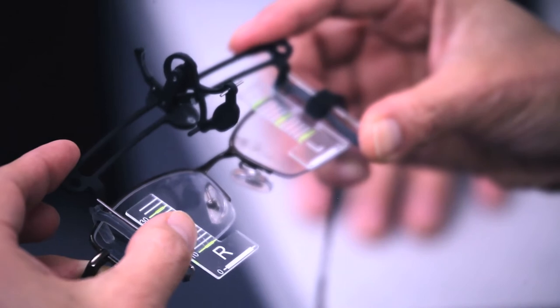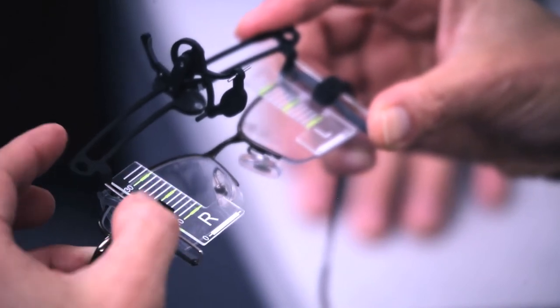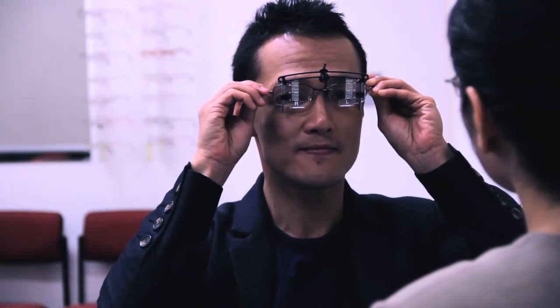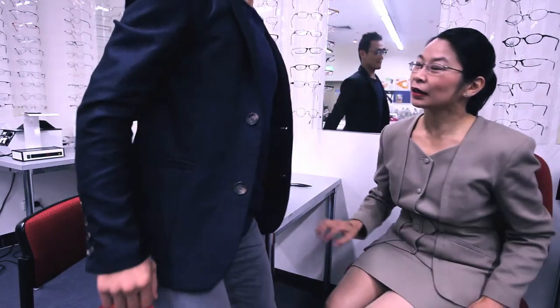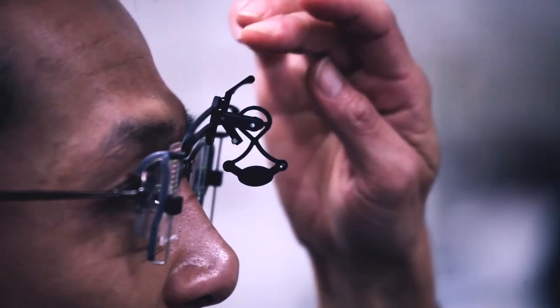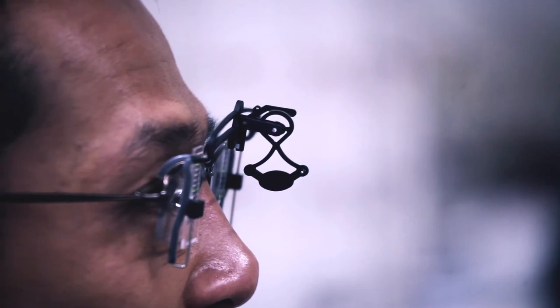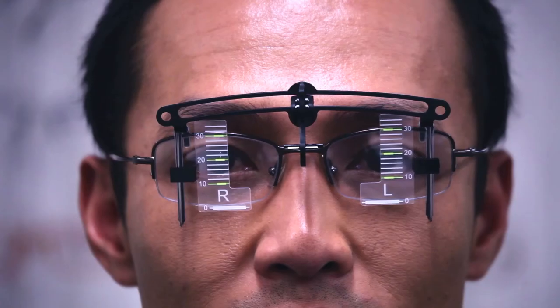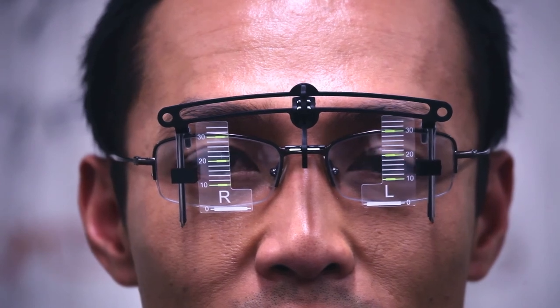Place the Y-Stick 2 on the frames and align the bottom zero mark to the bottom of the frames. After returning the frame, ask the client to stand in a relaxed natural posture looking straight ahead. From the side, lightly touch the brake arm to lock the swing assembly. Once the brake arm is locked in place, the Y-Stick has aligned the pins to the client's natural position.